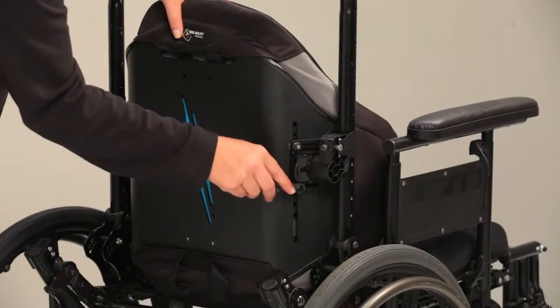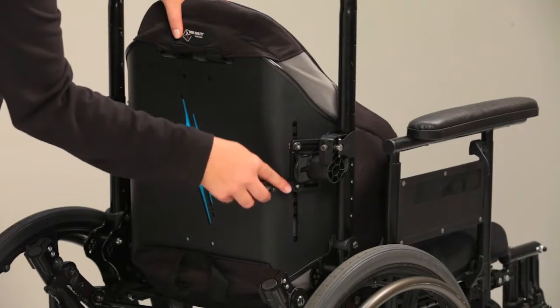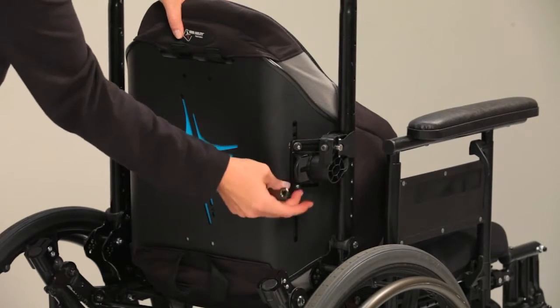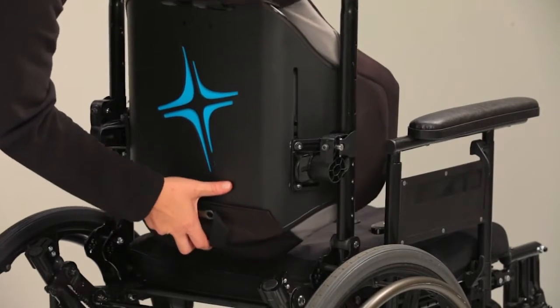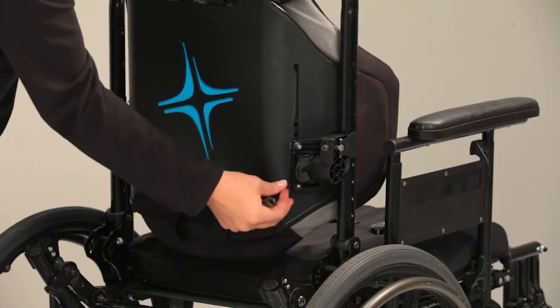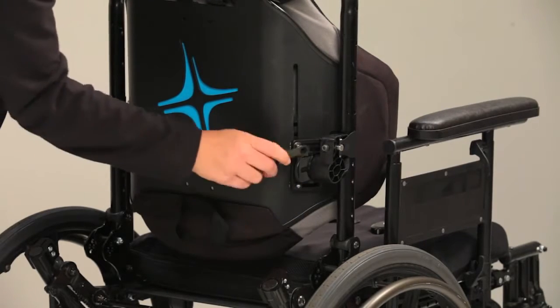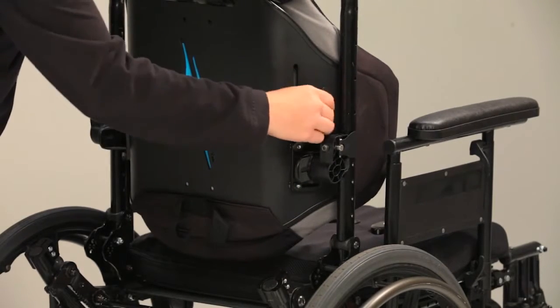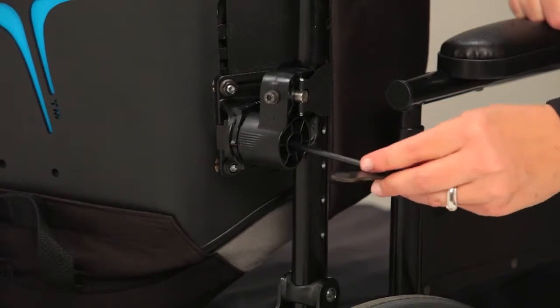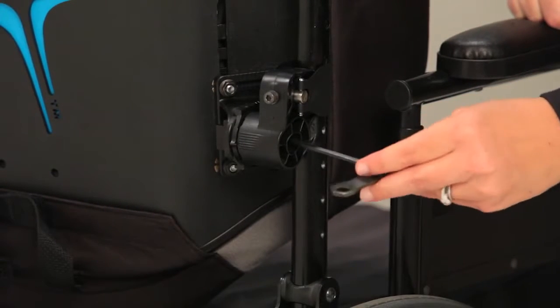To adjust the height, loosen the nuts on the width and height adjustment bolts with the box end wrench. Slide the back shell up and down in the vertical slots until the desired height is achieved. Tighten the nuts on the width and height adjustment bolts with a box end wrench until snug, plus a quarter turn. To adjust the seat depth, loosen the adjustment bolt approximately 3 full rotations.